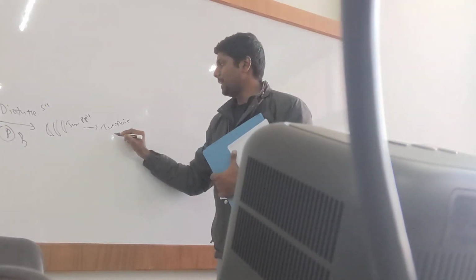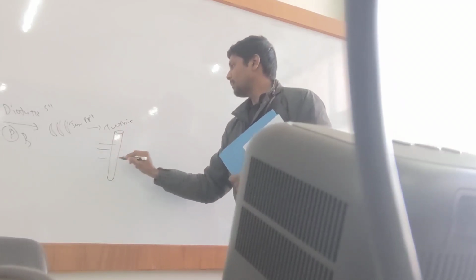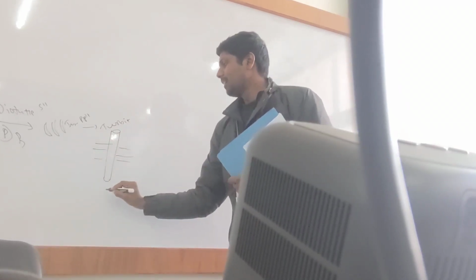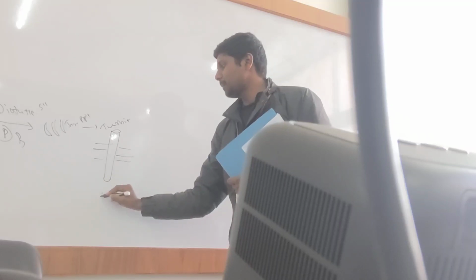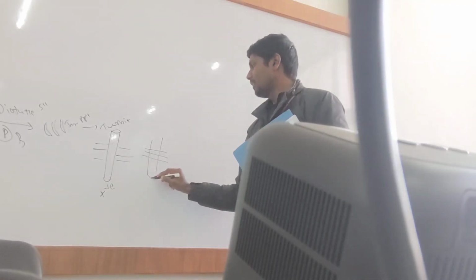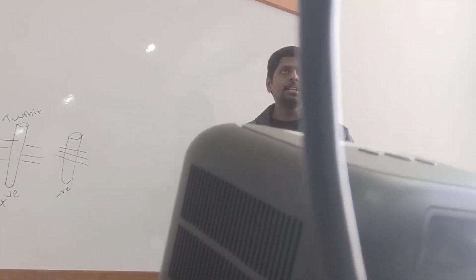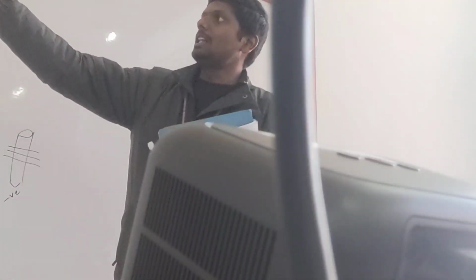This turbidity will be detected by placing the tube behind a ruled line. If it is turbid, the lines will disappear. That will be a positive test. If the lines are still visible, then this is a negative test for sickle cell. That's it. Now listen. This test is called a sickle cell solubility test.